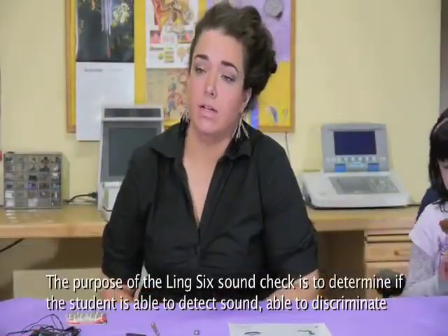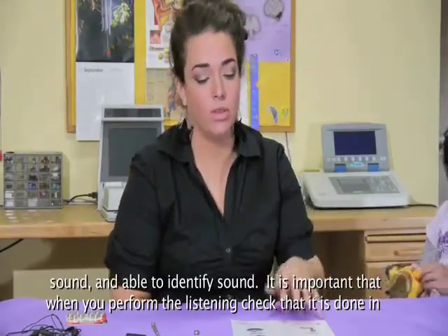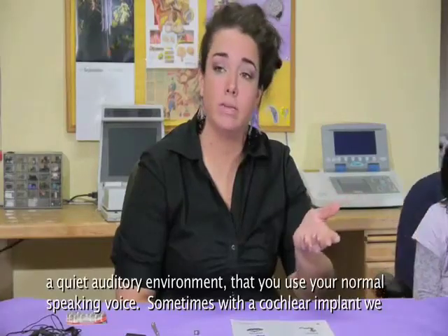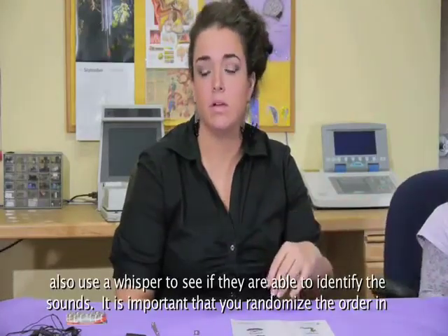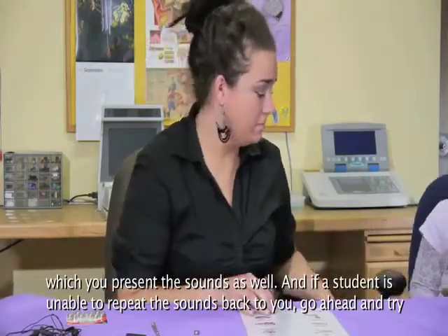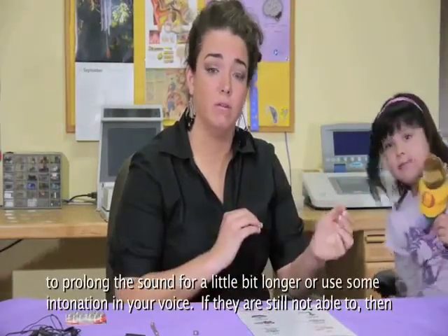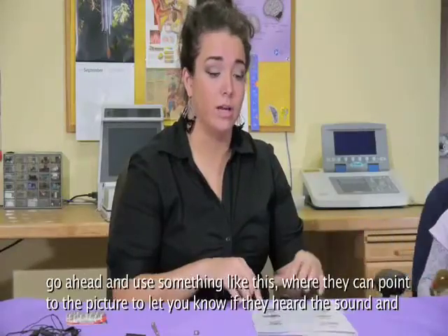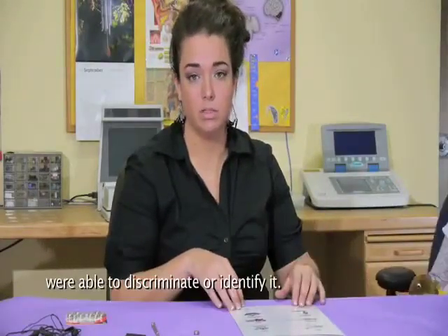The purpose of the Ling 6 sound check is to determine if the student is able to detect sound, discriminate sound, and identify sound. It's important that when you perform the listening check, it's done in a quiet auditory environment using your normal speaking voice. With a cochlear implant, we also sometimes use a whisper to see if they're able to identify the sounds. It's important to randomize the order in which you present the sounds. If a student is unable to repeat the sounds back to you, try prolonging the sound or using some intonation in your voice, or have them point to a picture to indicate they heard or identified the sound.